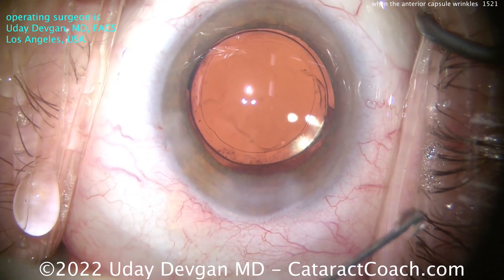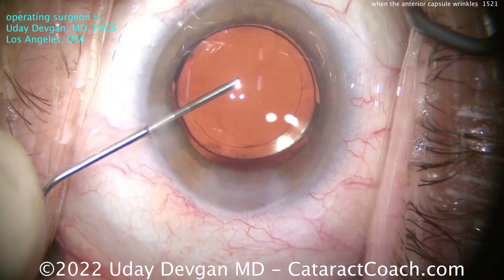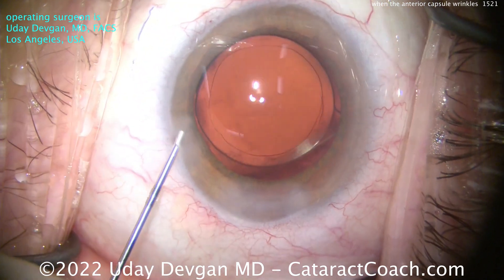That looks really good and that's going to be a beautiful outcome for the patient. A little more BSS, just getting that lens centered, making sure there's no retained viscoelastic inside the eye. Very nice outcome.